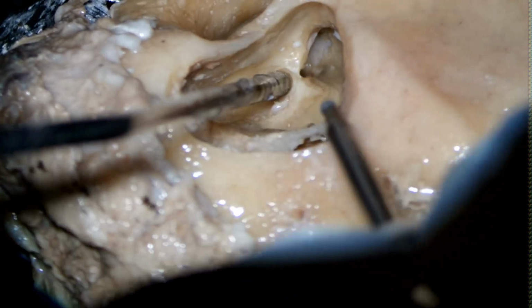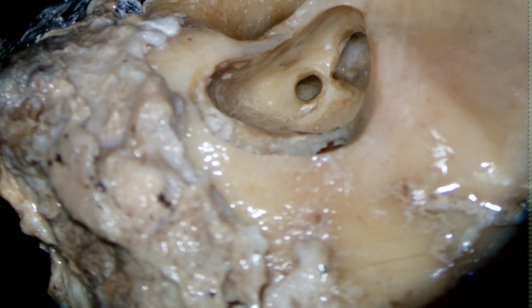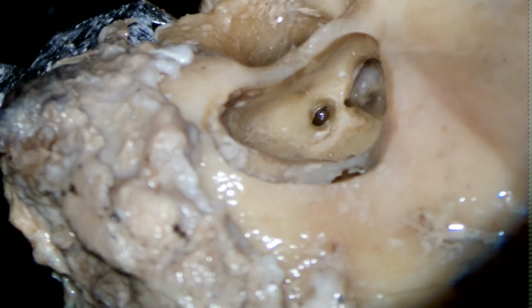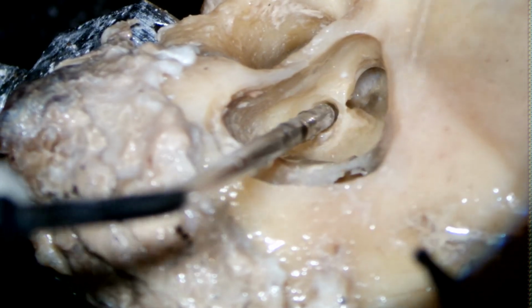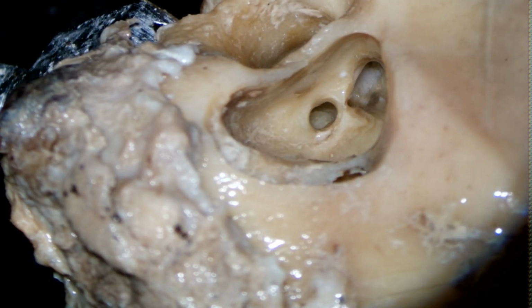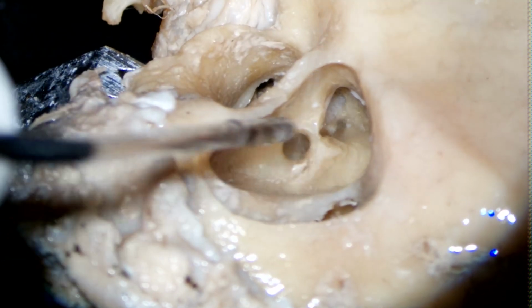And then you enlarge it and then try to see the round window basically. Most of the people now are doing round window insertion, and when you are seeing, you should try to see the stapes suprastructure first.